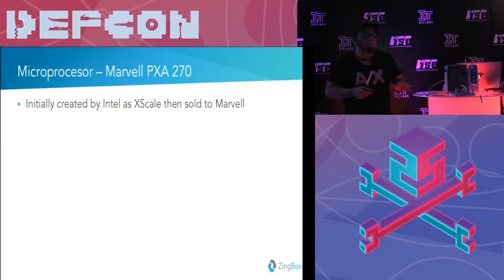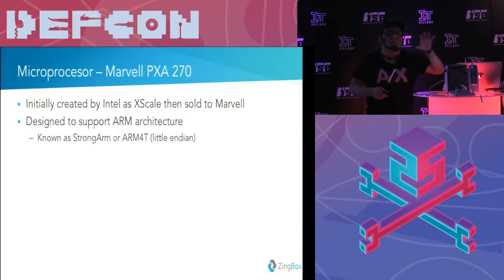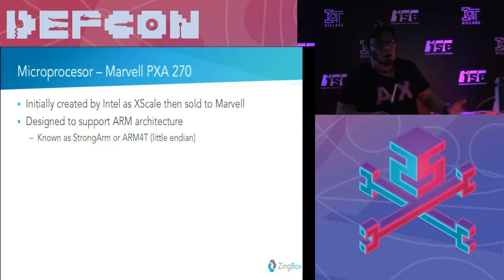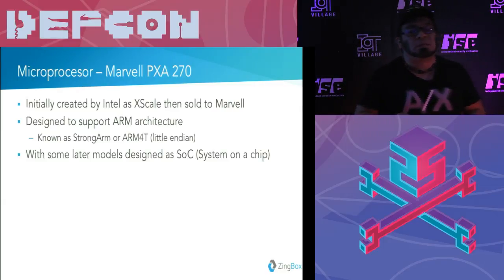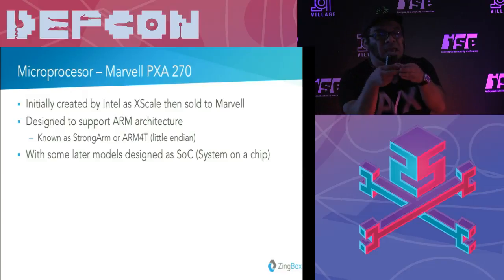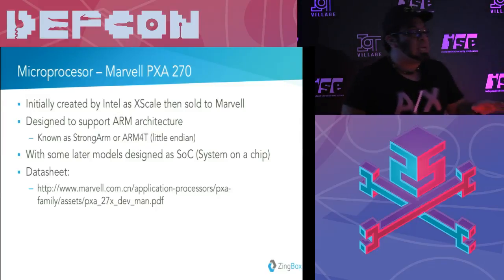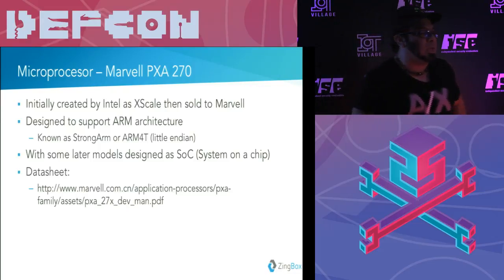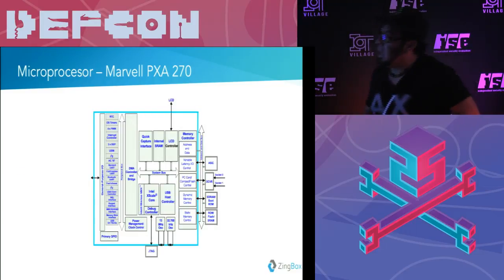Okay, so let's talk quickly about the architecture. This device runs an Intel XScale. It's very funny because XScale was from Intel, then Intel sold it to Marvell, and it was pretended to run a StrongARM, but then they switched it to ARM v5, which is the version that is running right now. It has models that run with a system on a chip, which is just a small chip running everything inside. Here is the data sheet. Basically, this chip is able to run Windows and Linux because it was based on Intel and then switched into the ARM architecture.